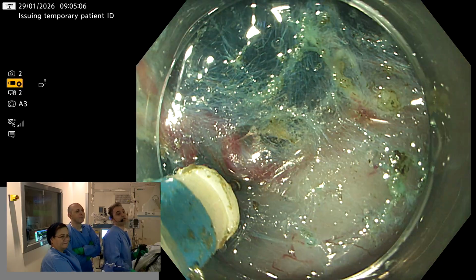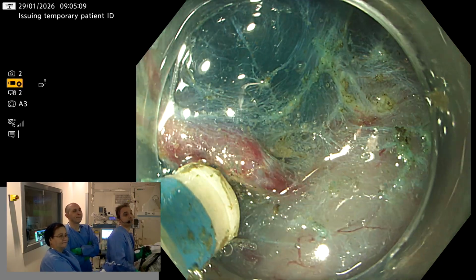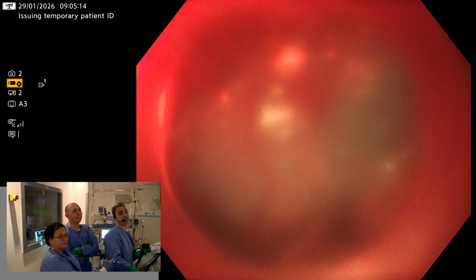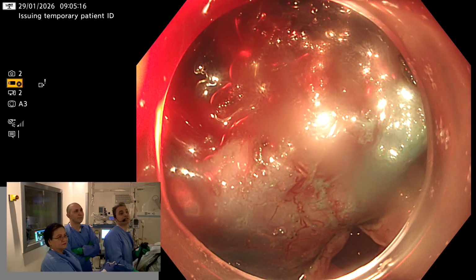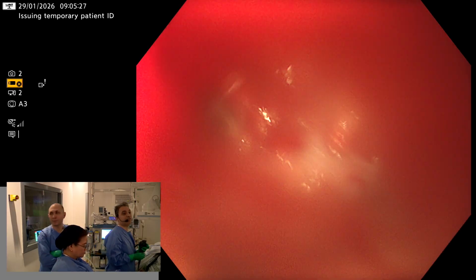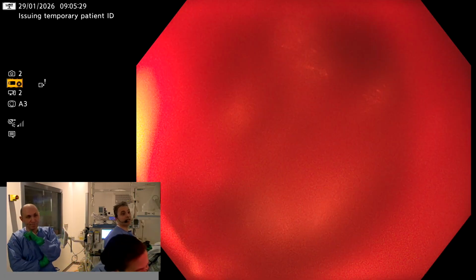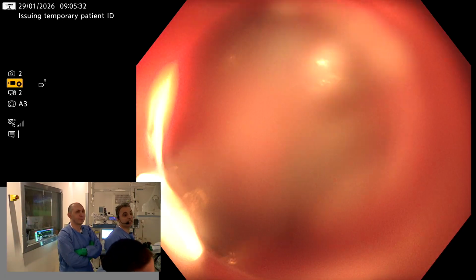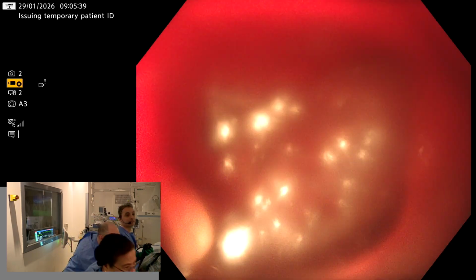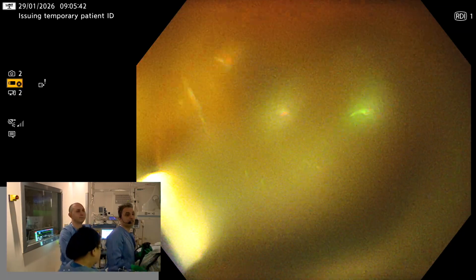The plan, I think we explained it initially, is that we make the most difficult side first, cutting the most difficult side. So here I have some bleeding, and the bleeding is arterial, so I will change to the RDI mode, and I change to spray coagulation 1.5 or 1.2, and I ask my assistant to change the mode to RDI if possible, without bringing further accessory. Okay, can needle in.